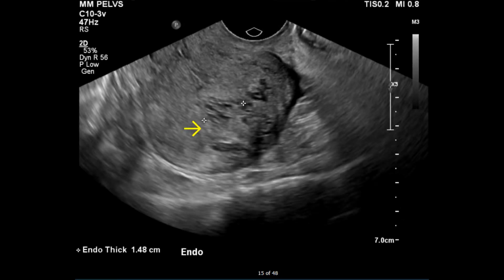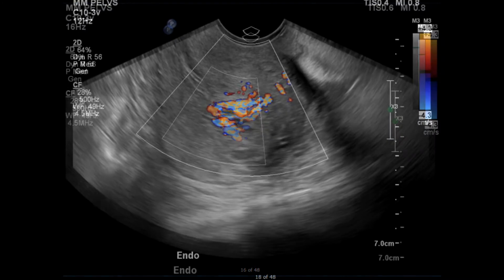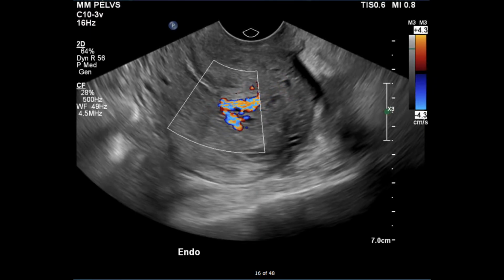conception. The differential diagnosis of a vascular uterine mass includes products of conception, enhanced myometrial vascularity, previously known as arteriovenous malformation, myoma, and various tumors. A high-flow vascular lesion, particularly with a peak systolic velocity of greater than 20 centimeters per second, is strongly suggestive of uterine EMV. Unfortunately, this patient's ultrasound study did not measure peak systolic velocity.